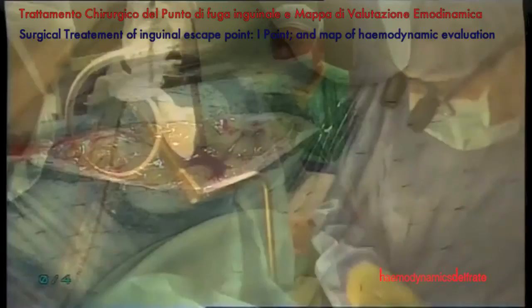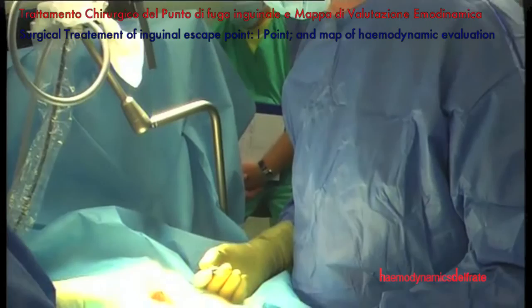This is the size of the cutaneous access.